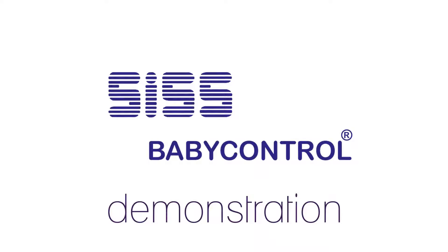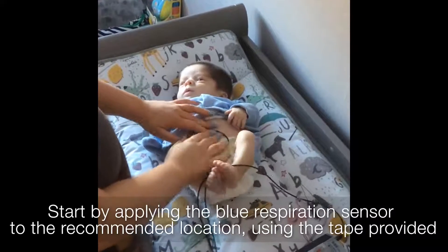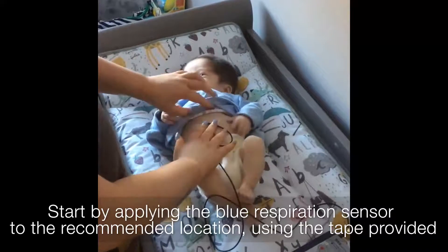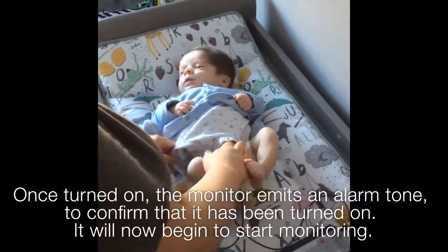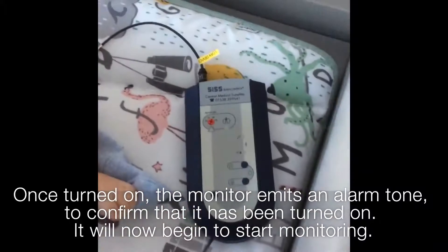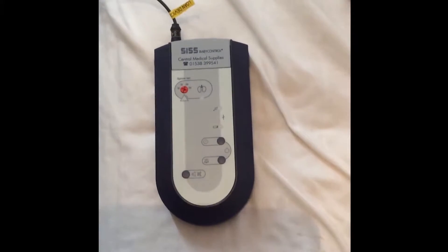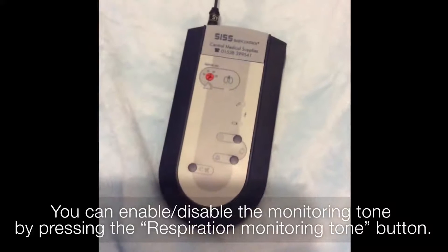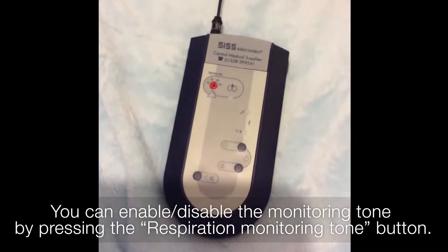You will now see a demonstration on how the SIS Baby Control monitor works. Start by applying the blue respiration sensor to the recommended location using the tape provided. The monitor emits an alarm tone to confirm that it has been turned on. It will now begin to start monitoring. You can enable or disable the monitoring tone by pressing the respiration monitoring tone button.